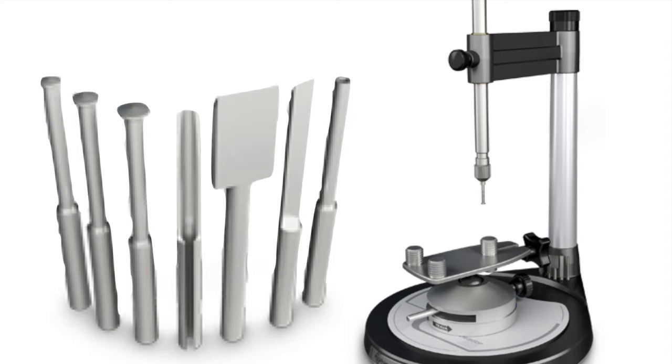These are the components of a dental surveyor. Here you're looking at the base, and this is the vertical arm, and this is the horizontal arm. And this vertical portion is called the mandrel, and the last thing is the surveyor table, which holds the cast to analyze. Plus the accessories: there's an analyzing rod, and these two are the wax carvers, and this one is the carbon marker holder. And there are 3 undercut gauges: 0.01 inch, 0.02 inch, and 0.03 inch undercut. So these are the components.